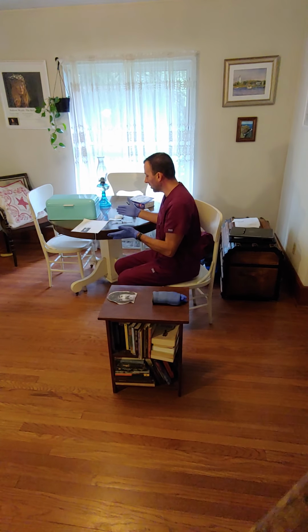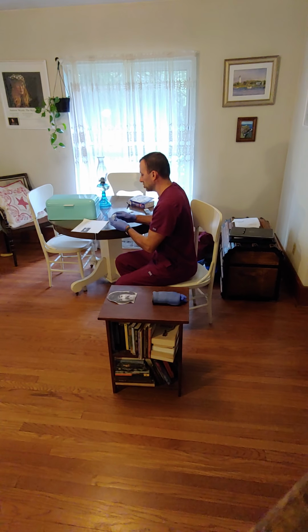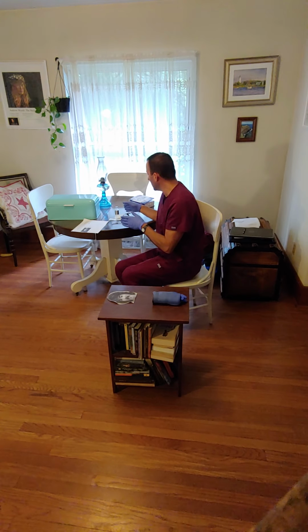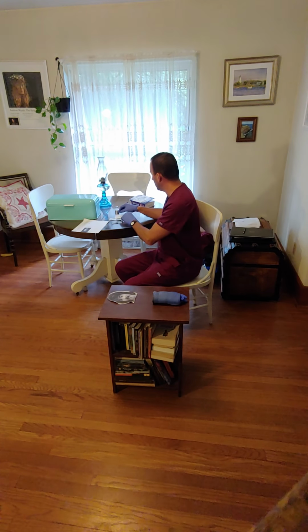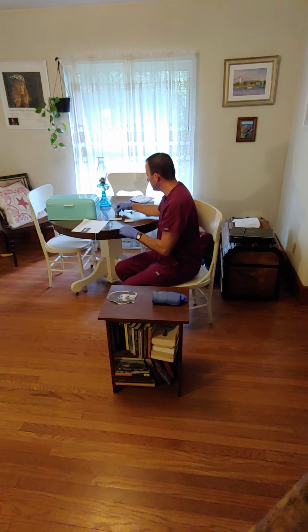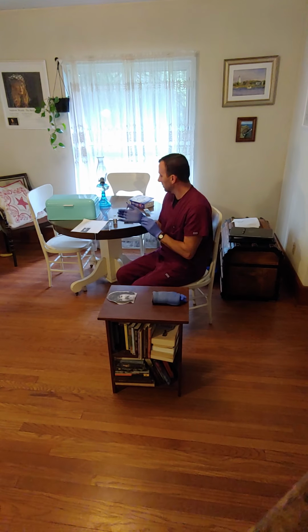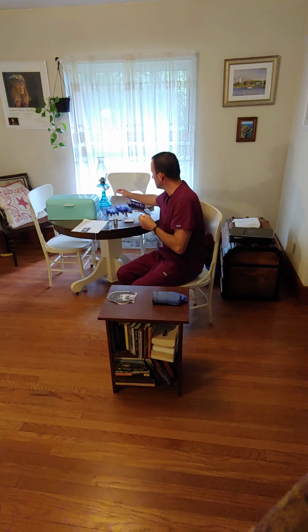At the point that we're doing our preparation, again, we're going to do our second check and make sure that we have the right medication, which we do. So we've done our 2 checks. And we're going to make sure that the medication is always in our possession or always in our line of sight. We're going to go into the patient's room. Actually, I'm going to take this PPE off. Do hand hygiene.